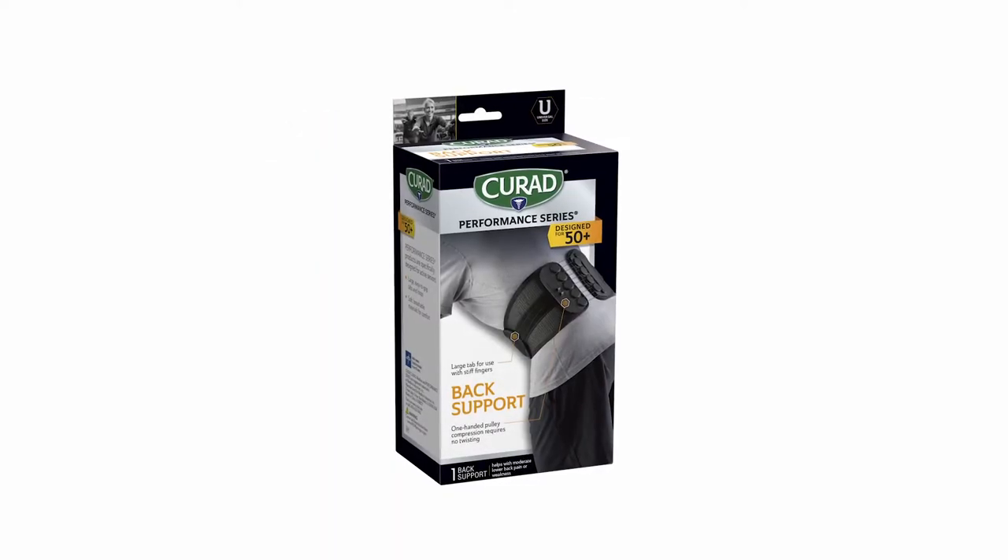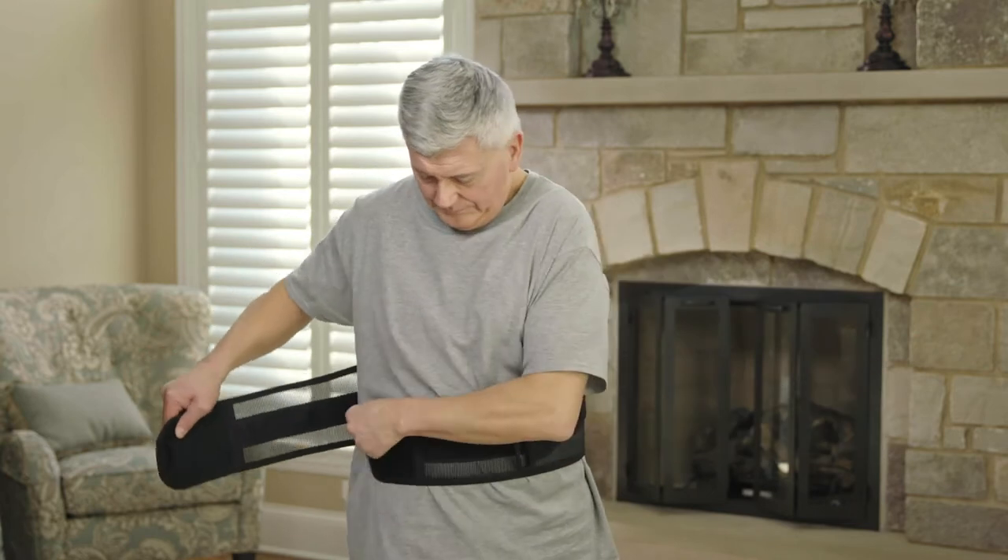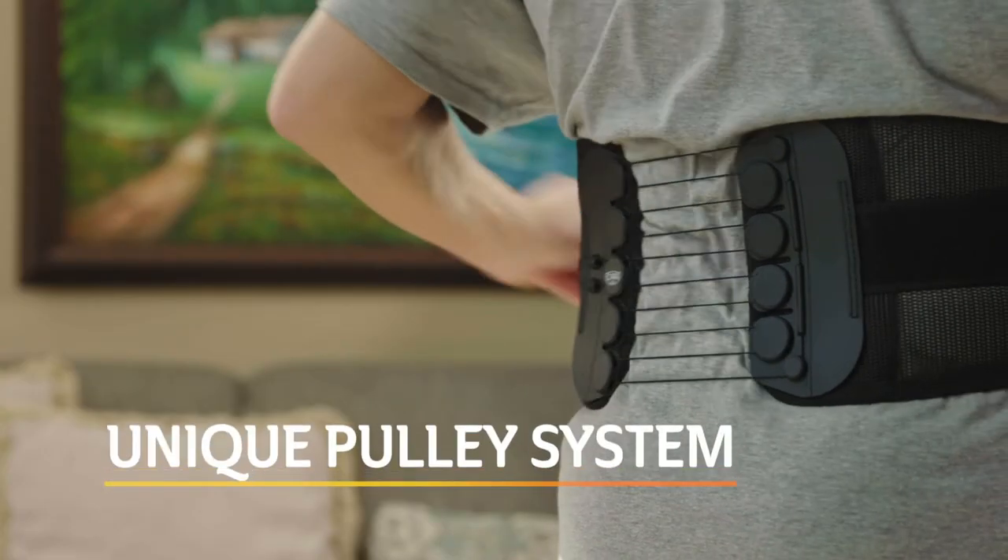The Curad Performance Series 50 Plus Back Support helps seniors recover, prevent injury, and provide support to stay active. Simply wrap the support around your torso and use the pulley handle to easily tighten.